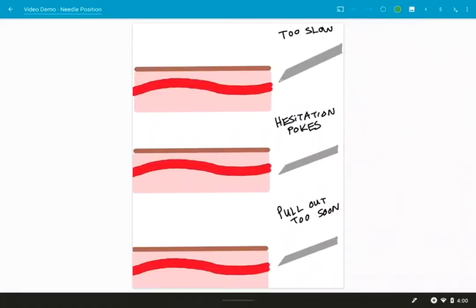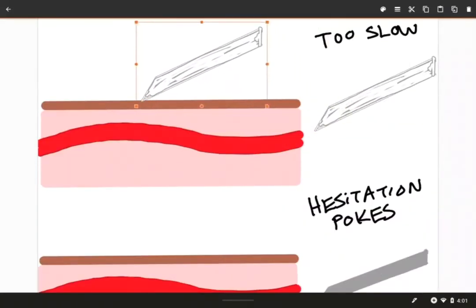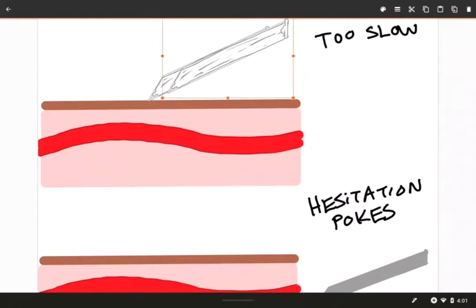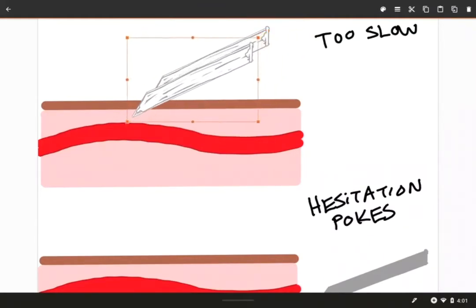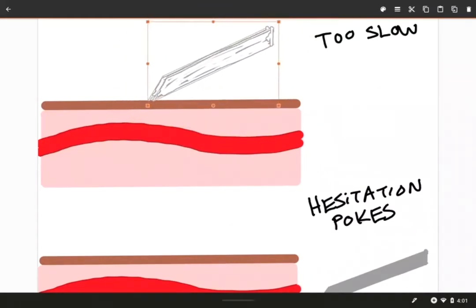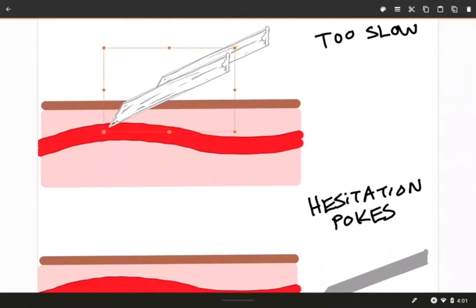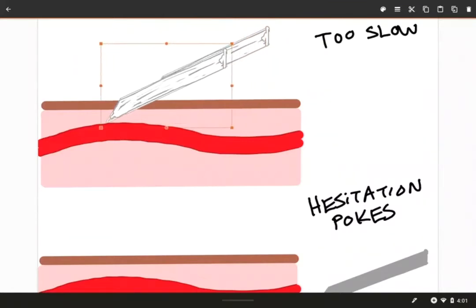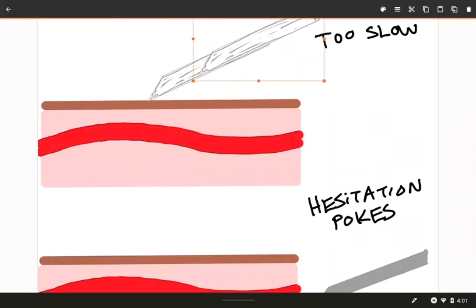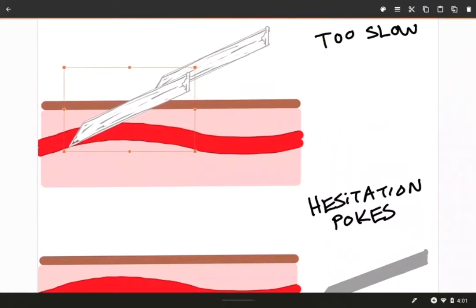Okay. We can talk about how fast to put the needle into the arm. If we insert the needle too slowly, that is going to increase the amount of time that your patient is in pain. So you're spending more time in this tissue area. If I go at this rate, that's too slow. I want to be like a nice quick motion like that.